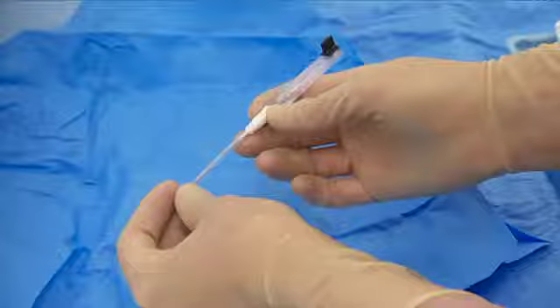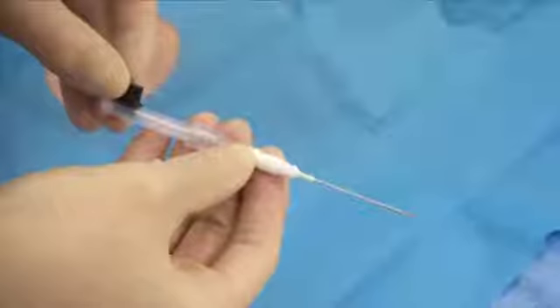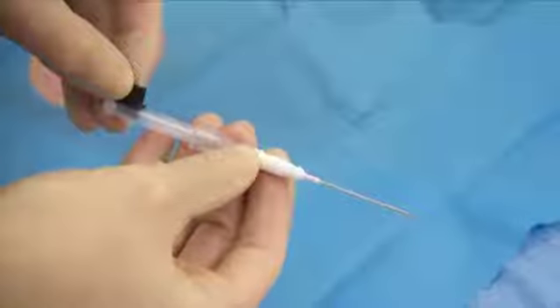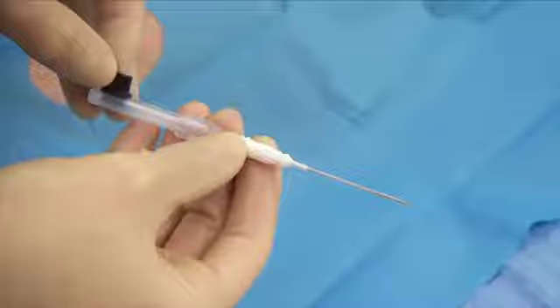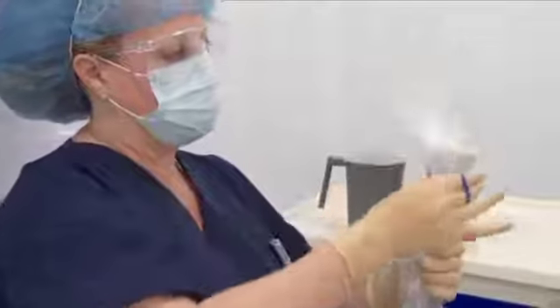Now, we will review the catheter prior to insertion. Remove the protective shield from the placement device. Be sure to test the advancement and retraction of the spring wire guide through the needle using the spring wire guide handle to ensure proper function. Note, prior to insertion, the spring wire guide handle must be returned to the original position before insertion, or blood flashback may be inhibited. Next, don sterile probe cover using sterile technique.